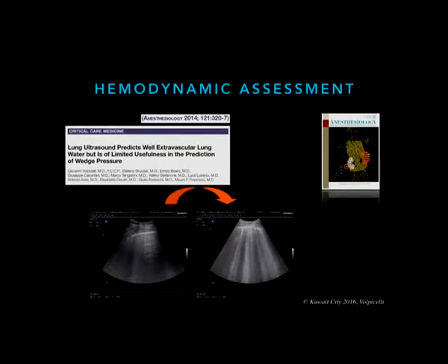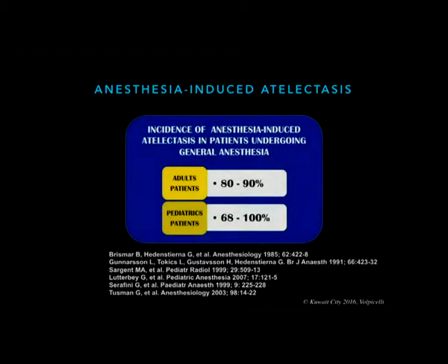When B-lines, the early signs of congestion, appear in your patients. And finally, the last very advanced application is the study of anesthesia-induced atelectasis. You know that this is a problem in our patients, not only in adult patients, but also in pediatric patients. The numbers are very high.